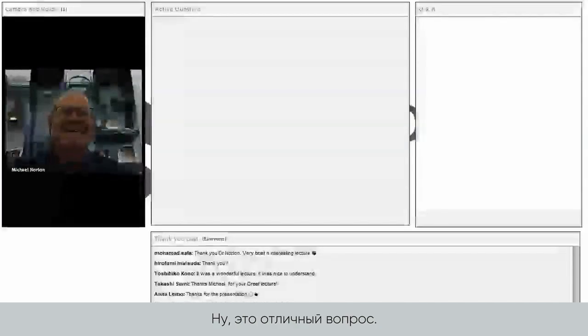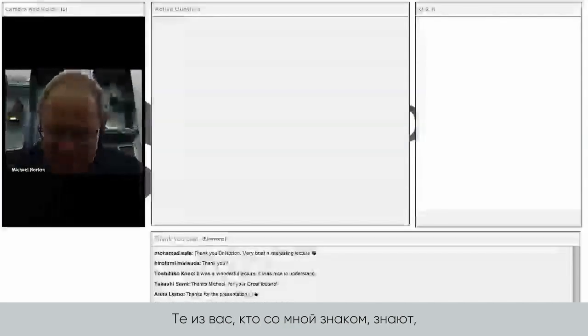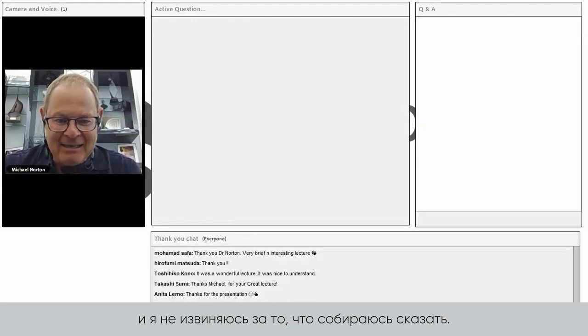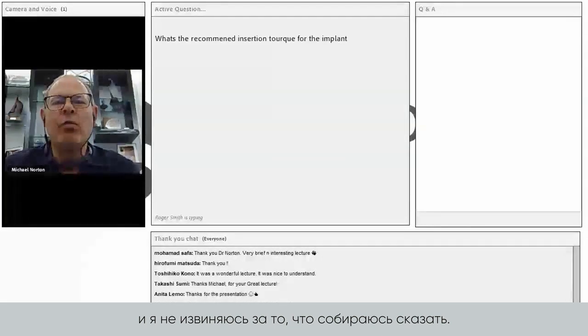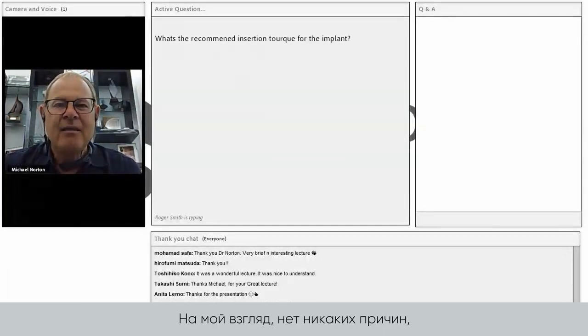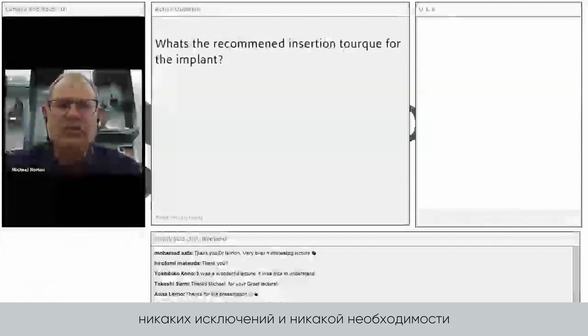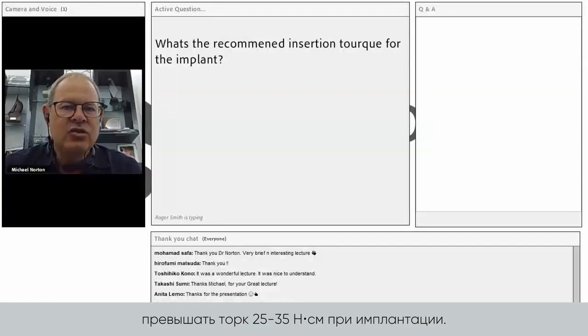Well, that's a great question, because those of you that know me know that it's a big issue for me. And I make no apology for what I'm about to say. There are, in my view, no reasons, no exceptions, and no need to ever exceed 25 to 35 Newton centimeters of insertion torque.